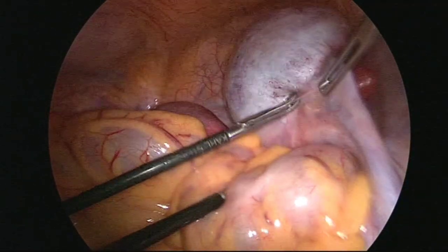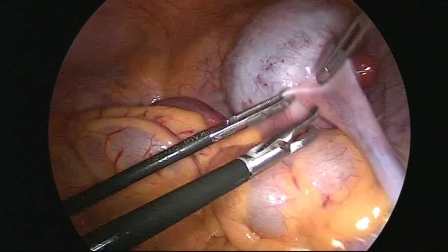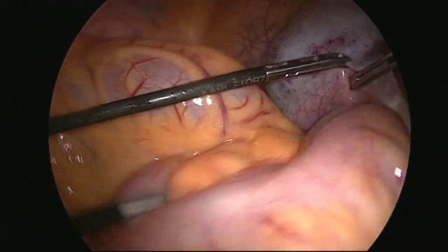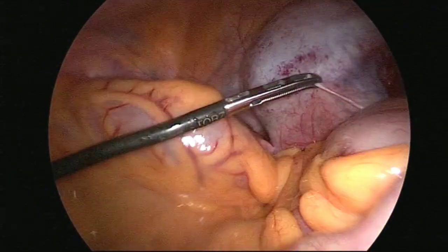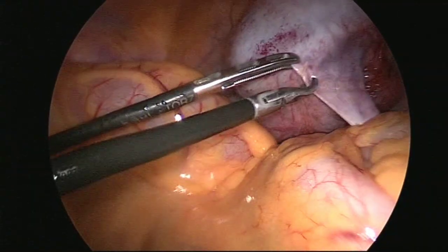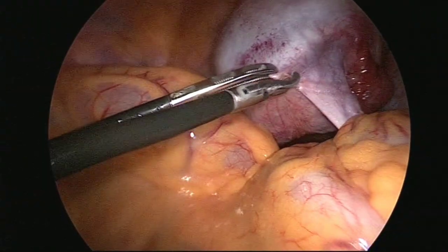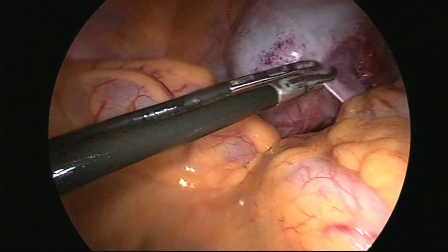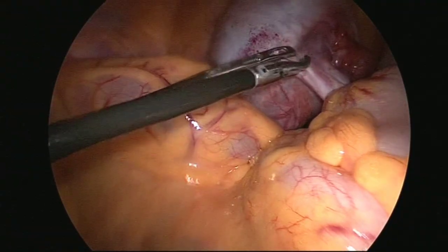So I will try to make a good plane in between the cyst and the ovarian tissue. I am using all atraumatic instruments so that there is no possibility of puncture of the cyst. Even after giving the head low, intestine is coming in between, and I am starting from the most loose connection of this cyst with ovarian tissue. Most likely I will be able to create the plane in between the cyst and the tissue.